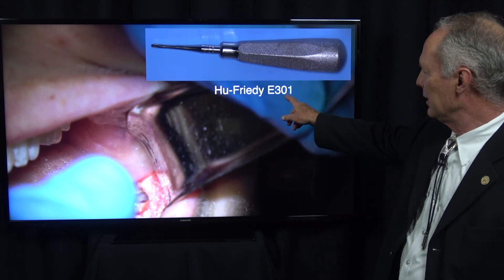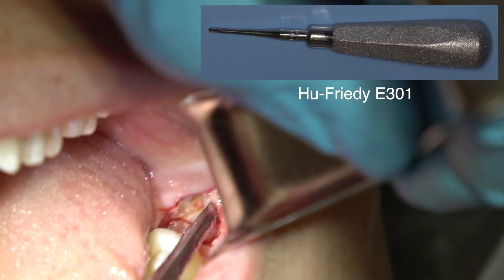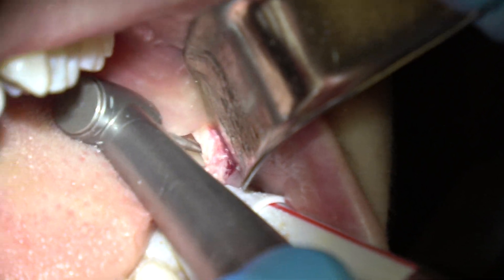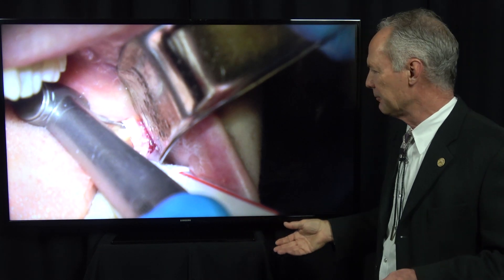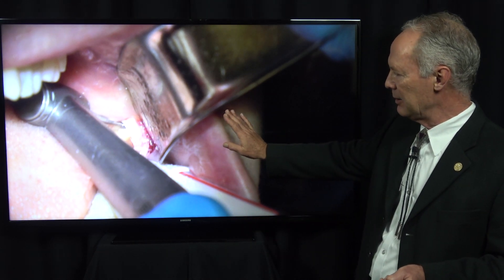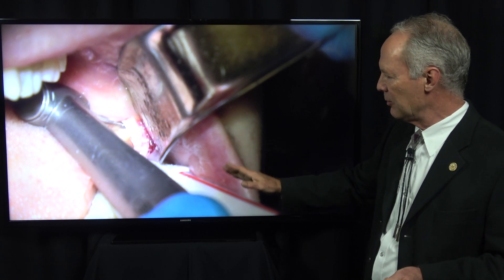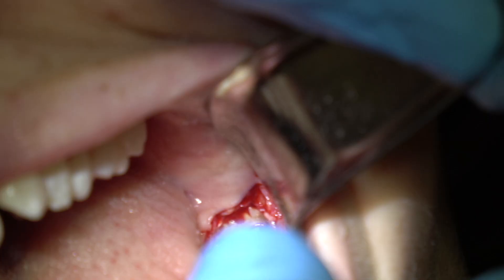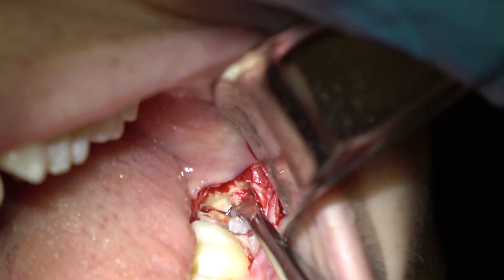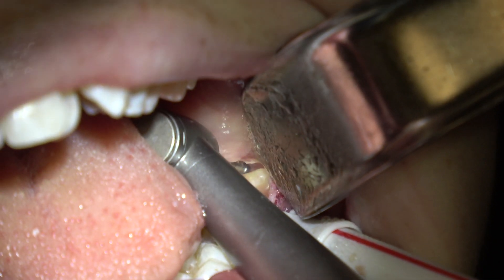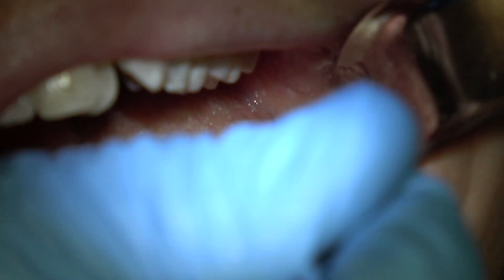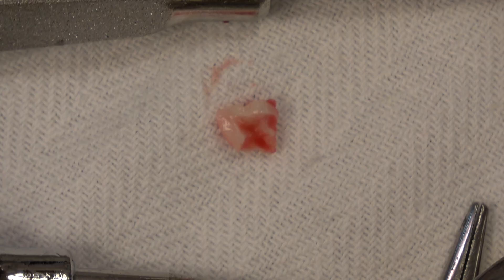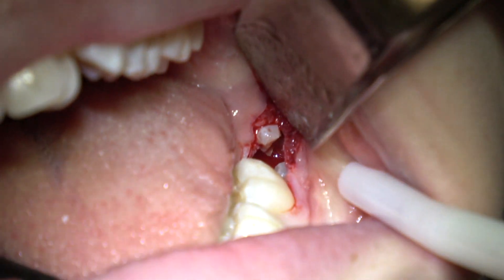I'm using an E301 elevator and elevating that distal part. I need a little more space to elevate into. Don't get in a hurry when you're doing this — it's difficult because it's in the distal back part of the mouth. You want to be sure you've got enough flap reflected for good access. Using the E301 again, taking that distal part out, creating a little more space. Now using a periosteal elevator — there's the distal part of the tooth.